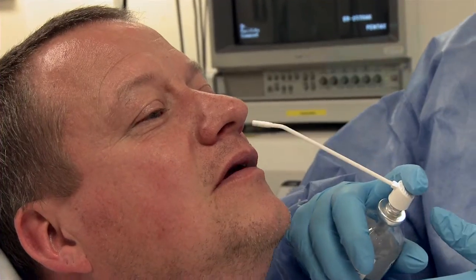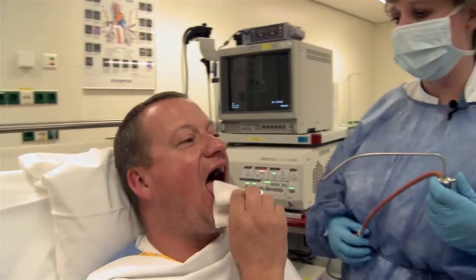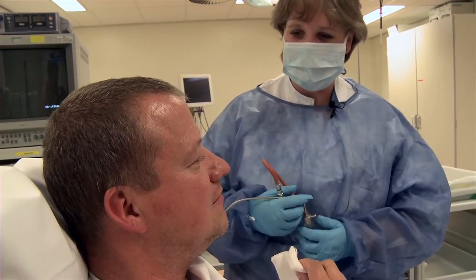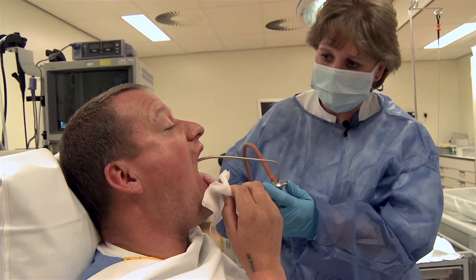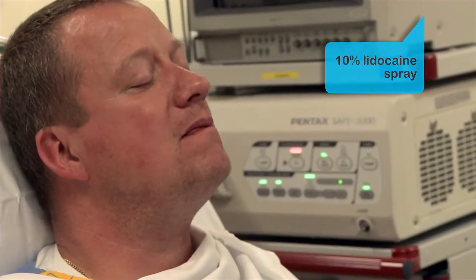This is followed by a 10% lidocaine spray. Subsequently, the tongue, palate, and pharynx are anesthetized with the 1% lidocaine solution. To eliminate the gag reflex, the posterior pharyngeal wall is thoroughly anesthetized. In order to adequately reach the posterior pharyngeal wall, the patient is asked to gently pull out their tongue with the help of a gauze. The 10% lidocaine spray is then applied to the posterior pharyngeal wall.